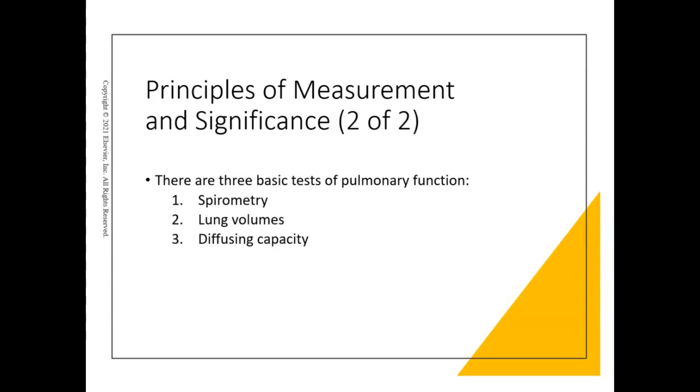When we're looking to identify the presence and degree of pulmonary disease, we typically perform what is commonly called a complete PFT. A lot of times physicians will order complete pulmonary function testing on a patient, and that means you're going to do all three of these tests with the patient.